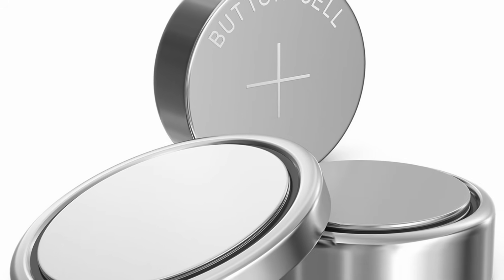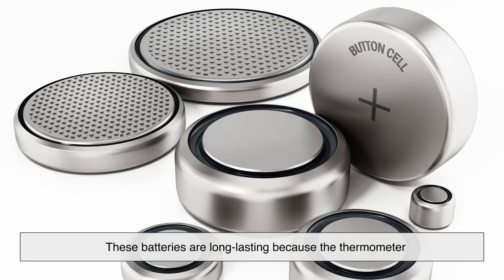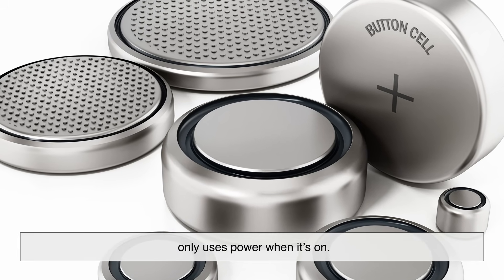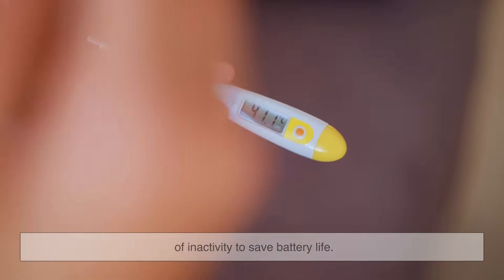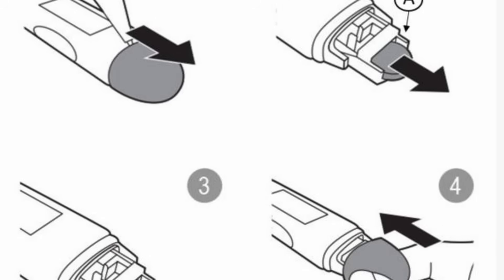Digital thermometers usually run on small button cell batteries. These batteries are long-lasting because the thermometer only uses power when it's on. Some models automatically turn off after a period of inactivity to save battery life. Replacing the battery is simple, and it can keep your thermometer running for years.